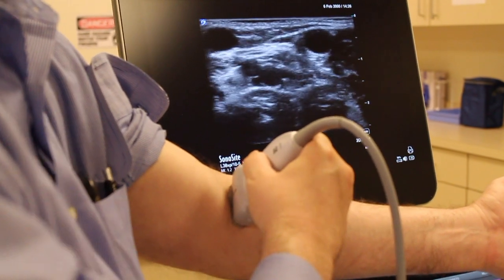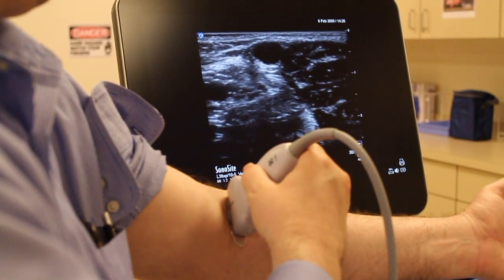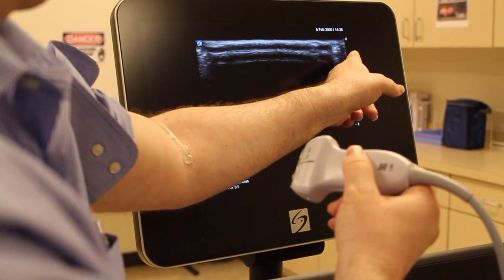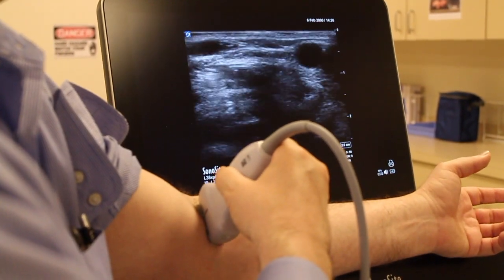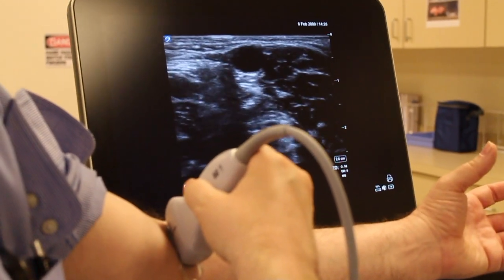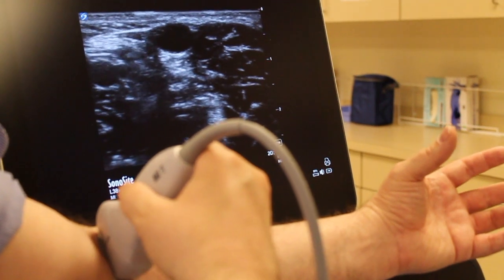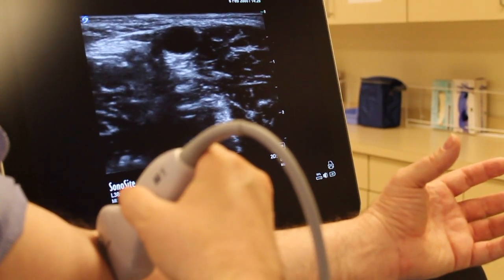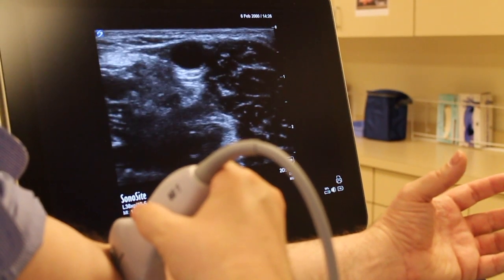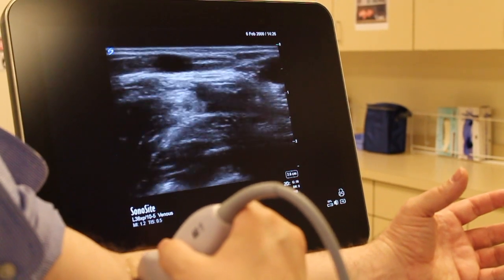I'm just going to pop this down on my AC. Look at that — we have some structures here. What I want you to notice is right there in the middle of the screen at about a half a centimeter deep. We have a vessel — a nice round image. Fluid and air don't carry the sound waves well, so they're going to appear dark on the screen. Another way I can tell it's a vessel is if I press down with my probe, it will compress.